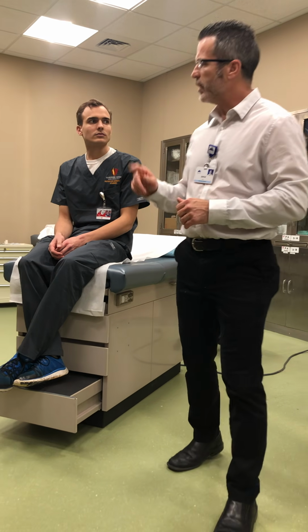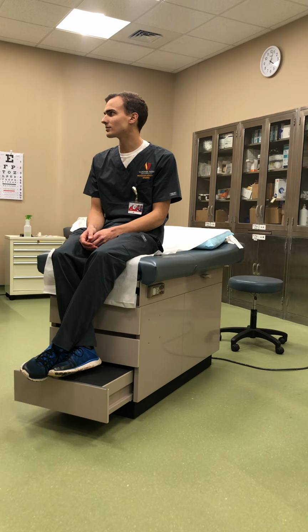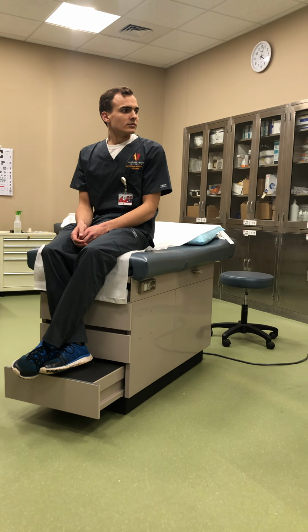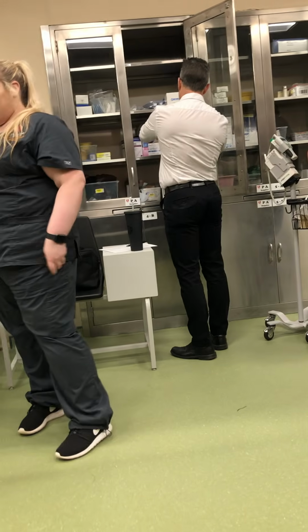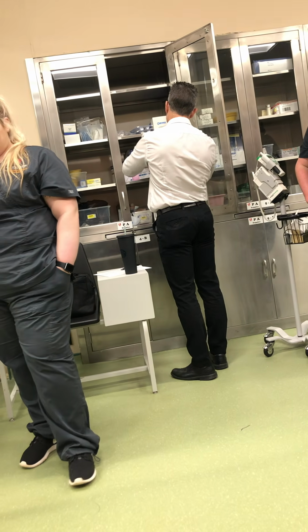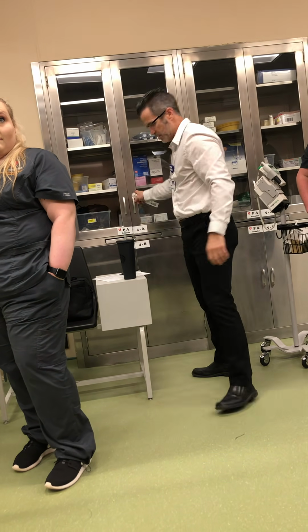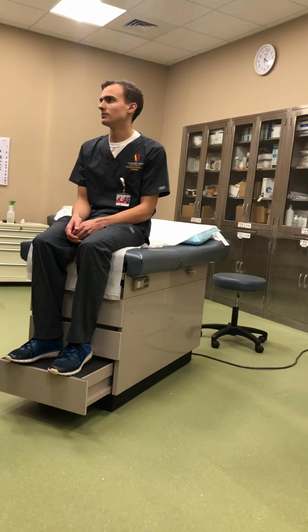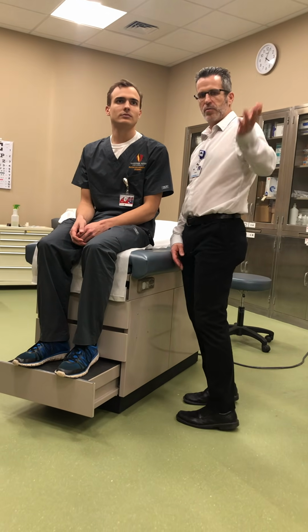So I will need an otoscope and an ophthalmoscope, so Seth's going to get that for me. I'm going to get a tongue blade, which is already out in the room for you guys, and which I am a big advocate of. Hint, hint: if you go through my group, you better use it. Better use it through any group, but especially mine, because these are underutilized in the clinic, other than the back of the throat for sore throat issues. So when the patient comes in, we'll let you go ahead and start.